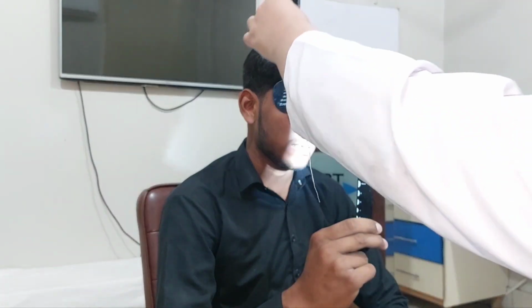So ideally the cover, uncover and alternate cover test, prism cover test should be done in bifoveal fixation. Okay, so we will do.